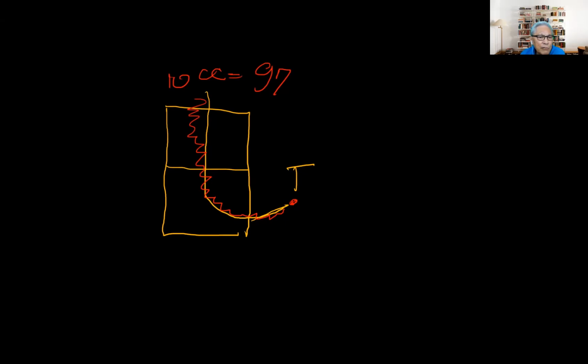That time interval is going to be determined by the time that the thermistor senses the temperature that you had introduced. So let's say I injected a solution at 97 degrees, and then the thermistor will sense when it reaches its end the time interval that it took for that solution to go from here, from the right atrium, all the way to the tip of the pulmonary artery, and that is calculated as the cardiac output.